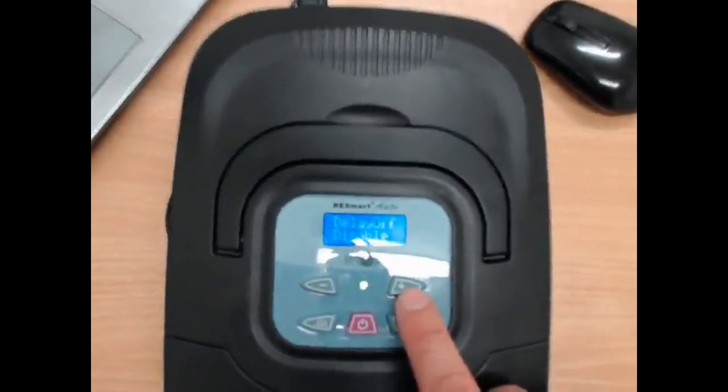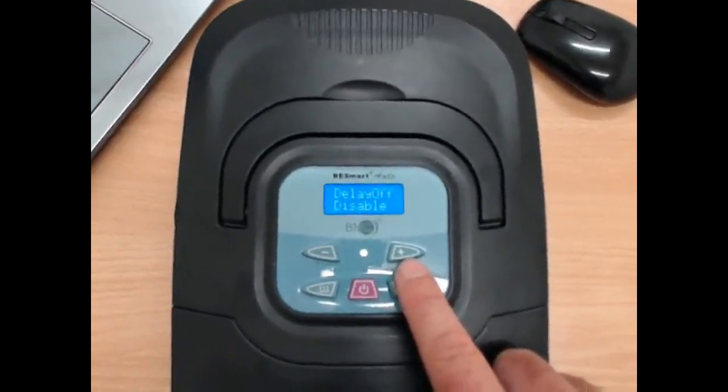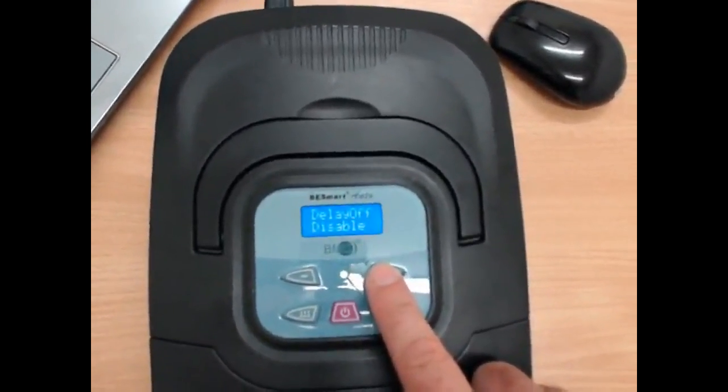Delay off disabled. Delay off is basically the machine has a little bit of a delay when you turn it off to run a bit of air through. It kind of dries out the tubing and so on, so it's up to you if you want to have that. You can have it enabled or disabled, it's not a big issue either way.